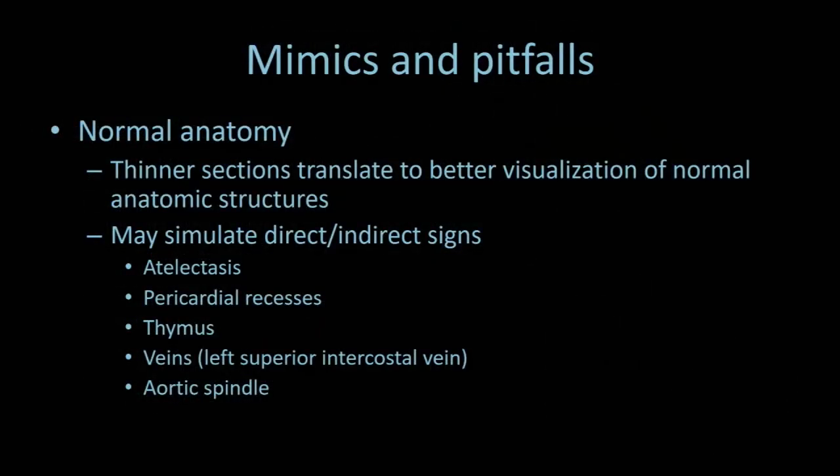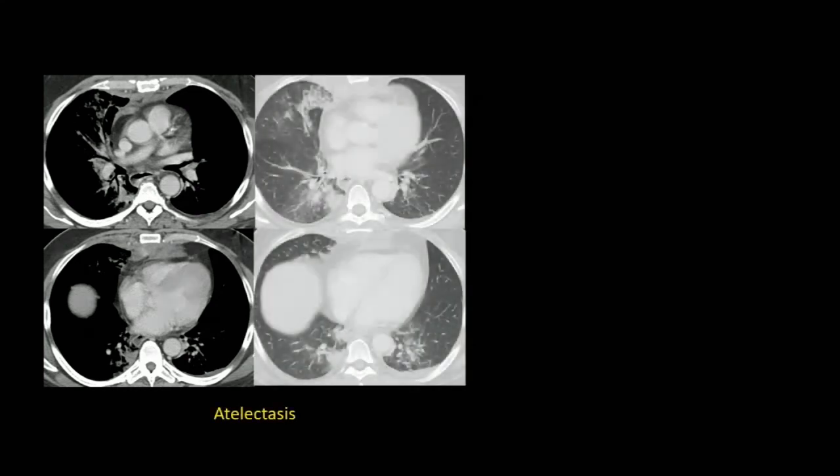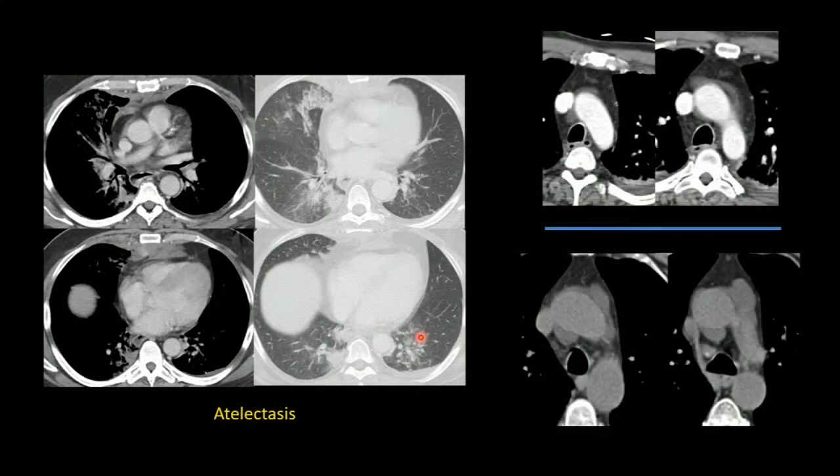Normal anatomy can also be tricky. Sometimes it can simulate the indirect sign of a mediastinal hematoma. It looks like there's some high attenuation material adjacent to the descending aorta. Put it on lung windows—that's actually just atelectasis. This patient has low attenuating material surrounding their ascending aorta. This measured about 10 Hounsfield units—these are simply pericardial recesses.